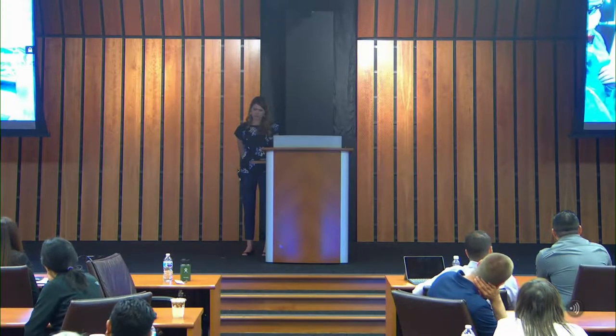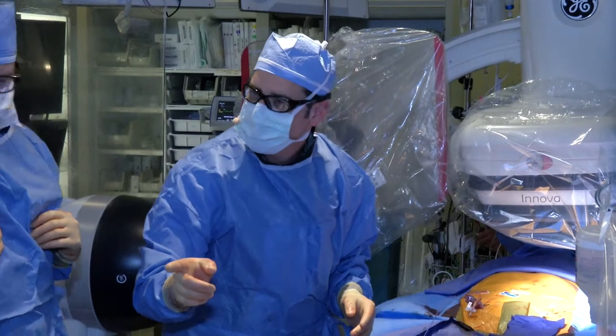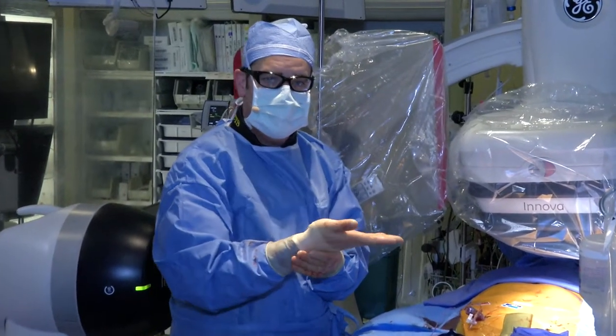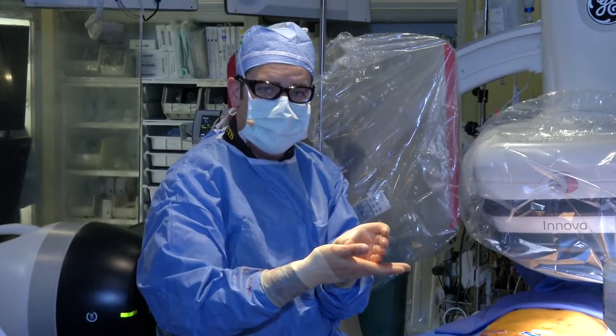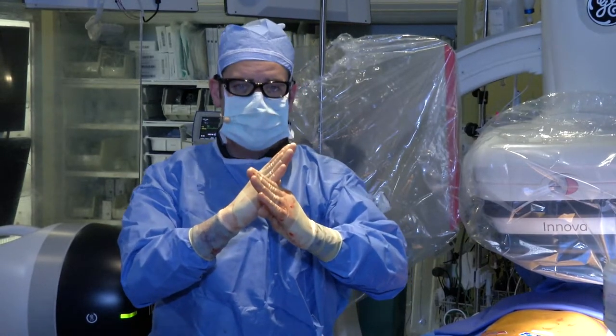You don't want to go more than 1 o'clock and 11 o'clock because if you turn it too much, can I have one of those? Did you already throw the Percloses away? Shoot. Okay, I was going to show you that there's a foot plate on it, and if you go too far, if the artery is small, the foot plate is actually wider than the artery, and you can rip the artery. So you don't want to go more than about 1 o'clock and 11 o'clock.